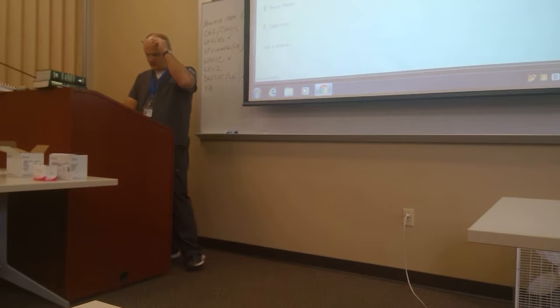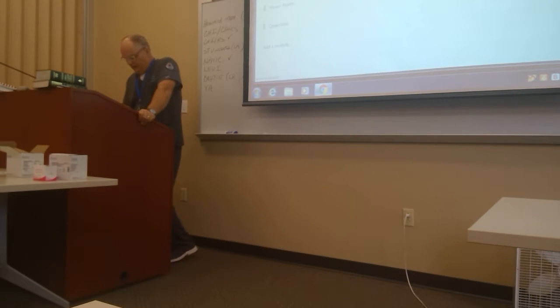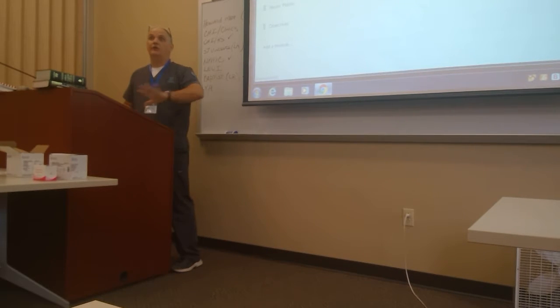So let's just keep going. What do you do, okay, if this doesn't work? It says, if there's no obvious explanation, you just retest it, okay? You do the test again and see if it comes in range. If it's out of control, we gotta do the next thing. So the next thing says, well, just throw that bottle that you added 60 mils of deionized water to, even though it's gonna cost the lab some money, throw it away.